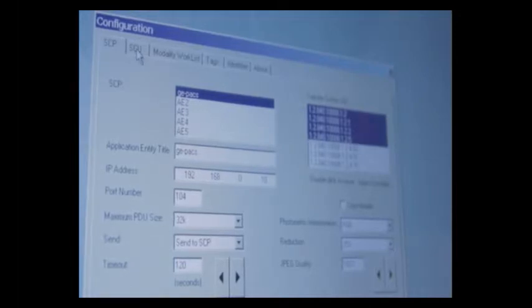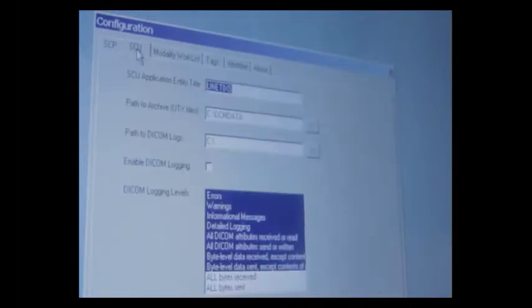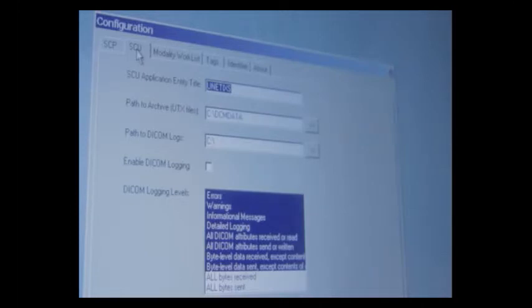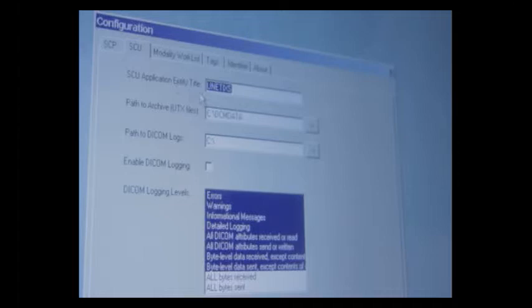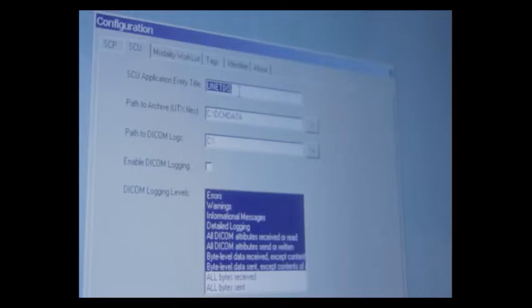The SCU tab is going to contain information about who your Multilab instrument is. The PACS server will assign the instrument its own AE title. It can be something like Unetix 1, it can be US 1, it can be anything you want. But this is going to be assigned to you by your PACS administrator.